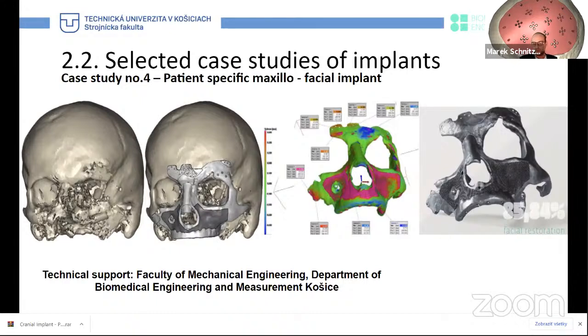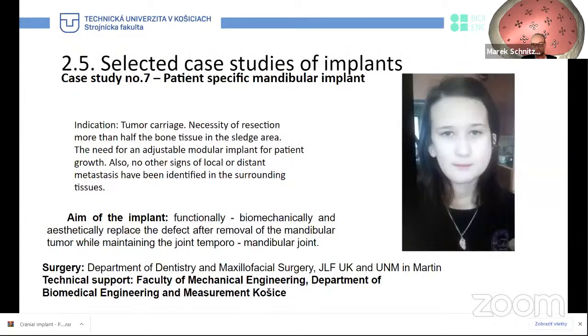He has a regime in the summer because the implant is thermoconductive, so he cannot be at higher temperatures, more than 30 to 34 degrees, for a long time, because he is affected by the heat. But the patient is good.